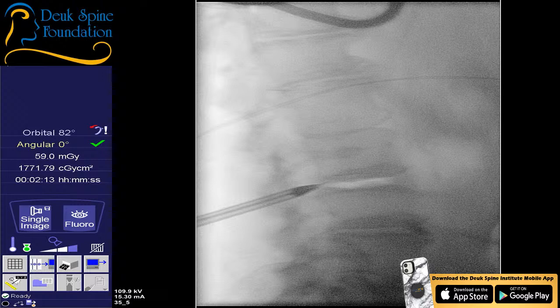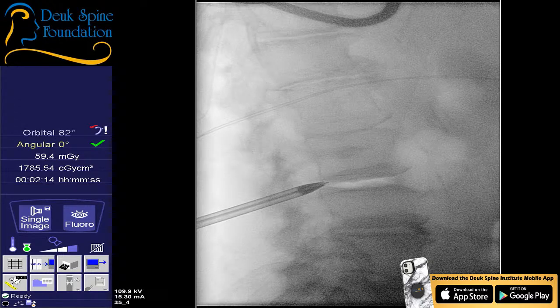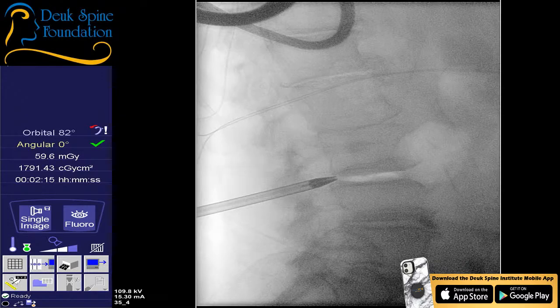I don't feel anything soft down there. It feels pretty standard, like I'm pushing through herniation behind the disc. But the fact that she's quiet and comfortable right now is somewhat reassuring. Like I said, we'll see. This particular disc is extremely collapsed on my side. So it's not surprising to me that we're having trouble getting in.